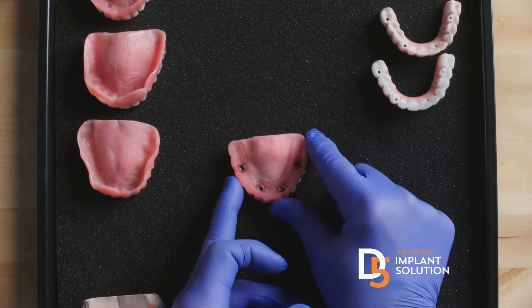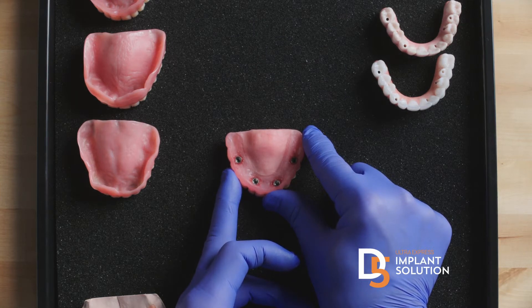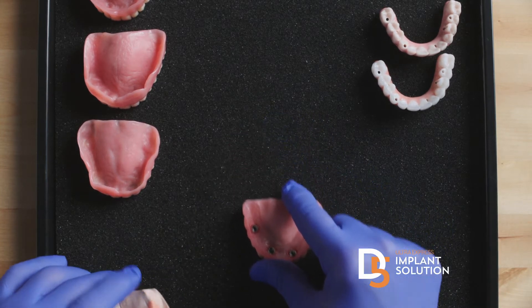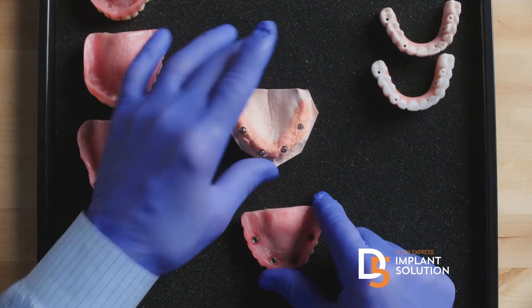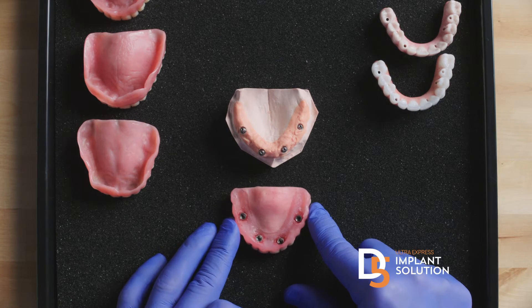I want to go over the difference between the 30-year-old teeth-in-the-day denture-based approach and the D5 digital approach to doing full-arch dentistry. What you're looking at here is the 30-year-old denture-based approach. What a lot of people don't realize is that at thousands of teeth-in-the-day implant centers, all you're really getting is a converted denture with temporary parts on the day of surgery.